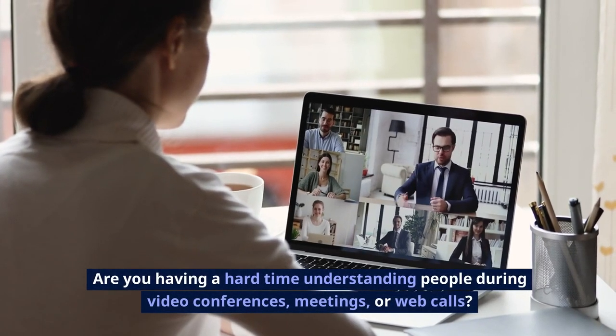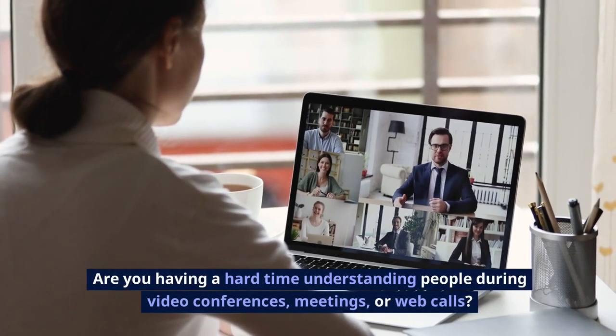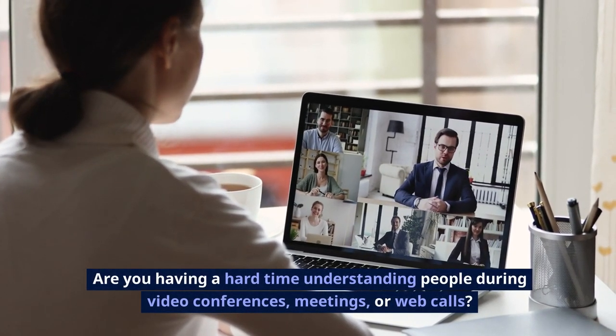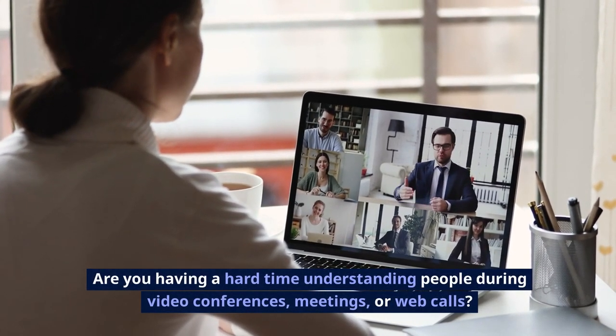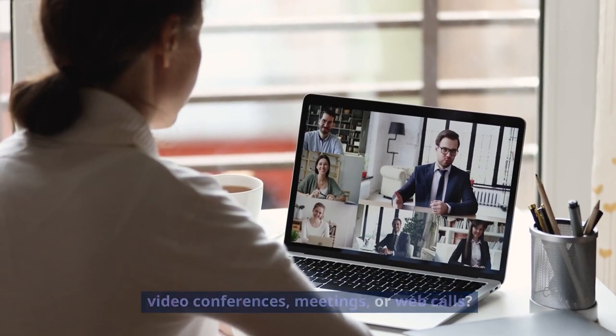Are you having a hard time understanding people during video conferences, meetings, or web calls?